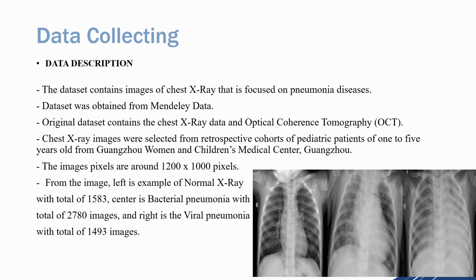The data set was obtained from Mendeley Data, and the original data set contains the chest X-ray data and optical coherence tomography. The chest X-ray images were selected from retrospective cohorts of pediatric patients of 1 to 5 years old from Guangzhou Women and Children's Medical Center, Guangzhou.